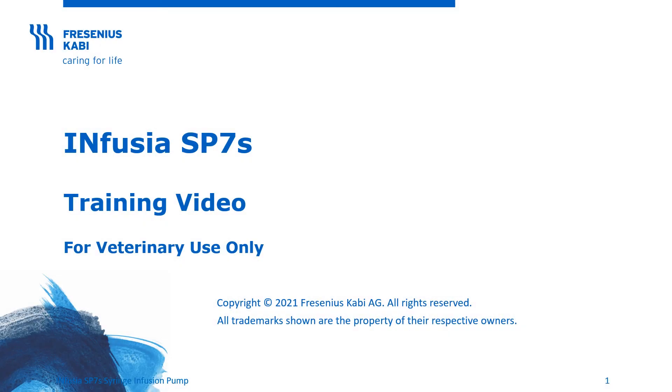Infusia SP7S training video. This product is for veterinary use only in the United States. The purpose of this video is to provide training on the use of the Infusia SP7S syringe infusion pump.